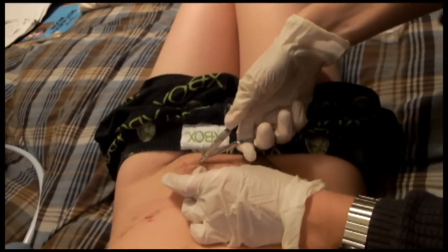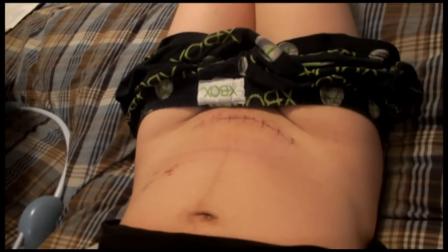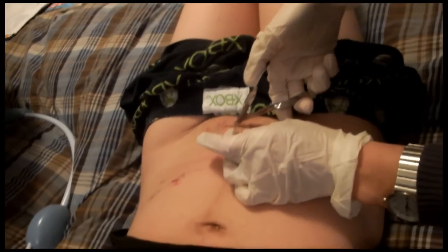It looks a lot better without the staples there, sweetheart. Did it flatten out a little bit? It doesn't look Frankenstein-y. It just looks like a line in your skin. The staples make it look real intense.